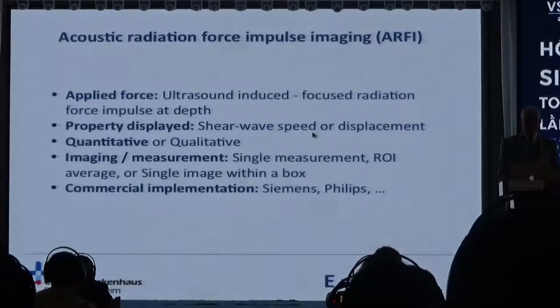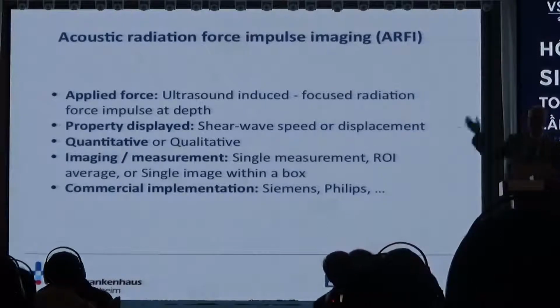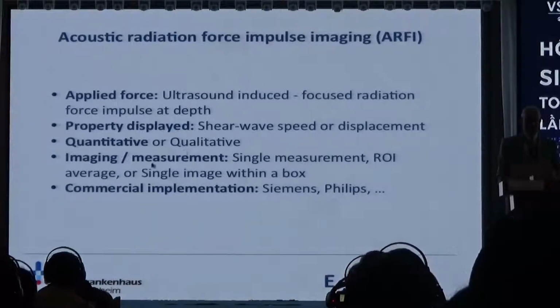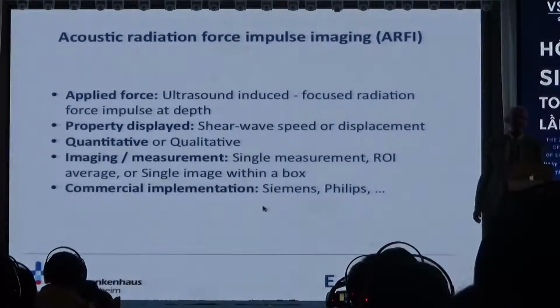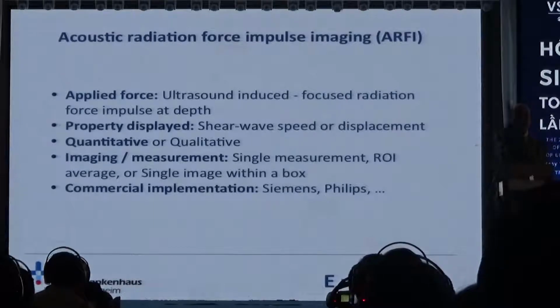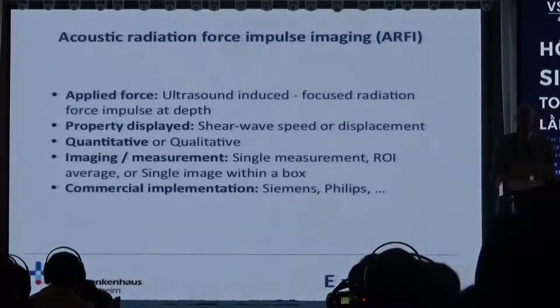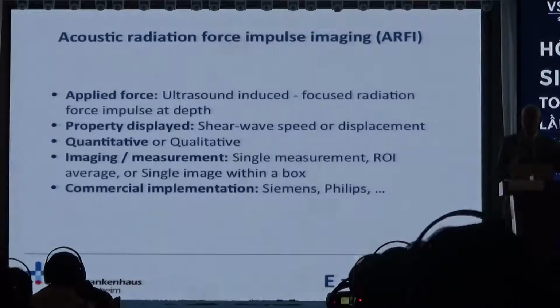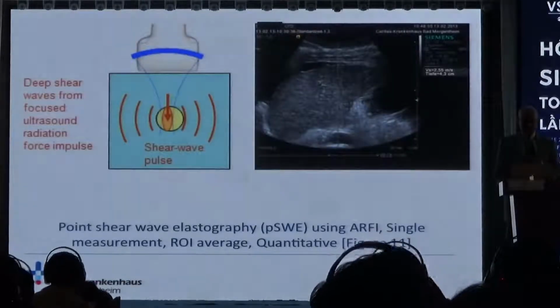The shear wave speed will be displayed. It can be displayed as a quantitative or qualitative measurement. It will be given in a single ROI, and it's commercially implemented right now by many manufacturers, first by Siemens, but later on also by Philips, Esaote, Mindray, whatever.